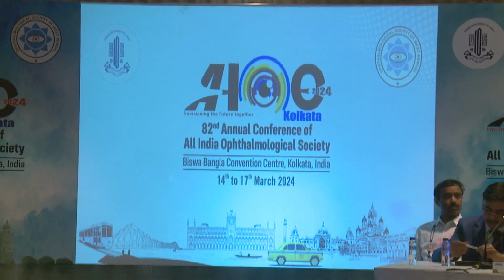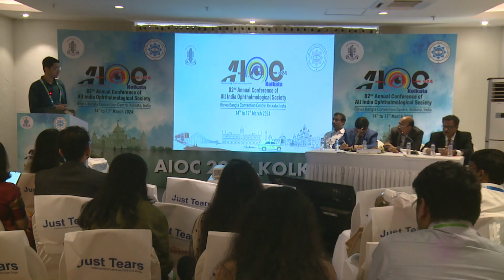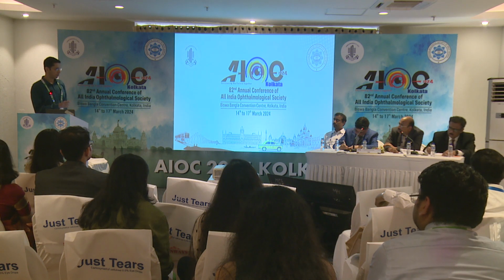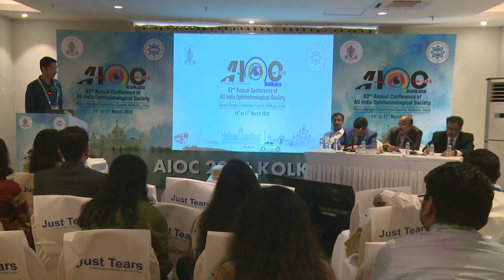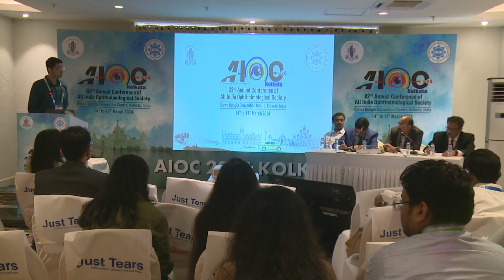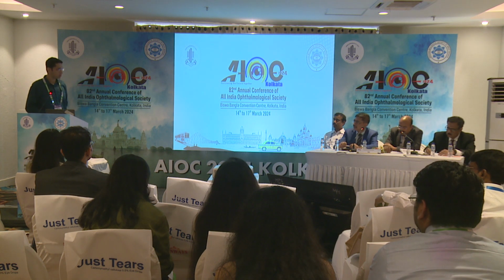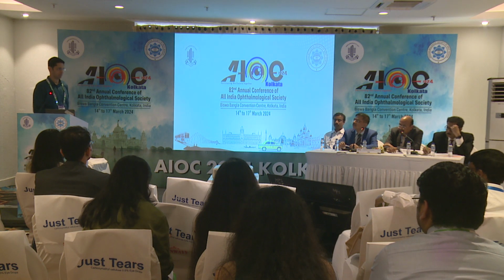How much was the sensitivity in the early AMD group? Sir, the device was trained only to pick up referable versus non-referable. But if you ask me, its overall ability to pick up any AMD was about 84%. According to your data, a lot of findings are missed in the early and intermediate groups. Those are the patients who require early referral and treatment. Advanced AMD anyway, I think. Referable AMD was classified as intermediate or advanced, so only early and no AMD cases were non-referable. Intermediate and advanced were referable.